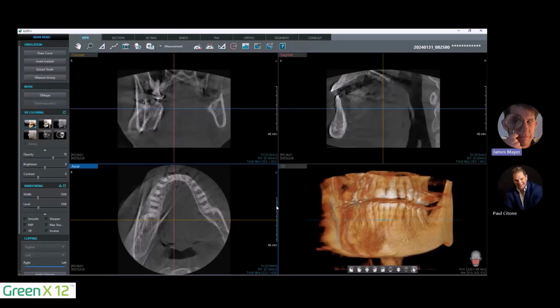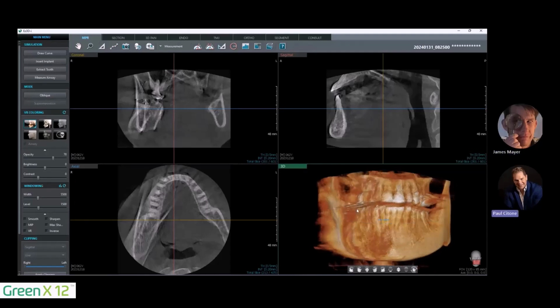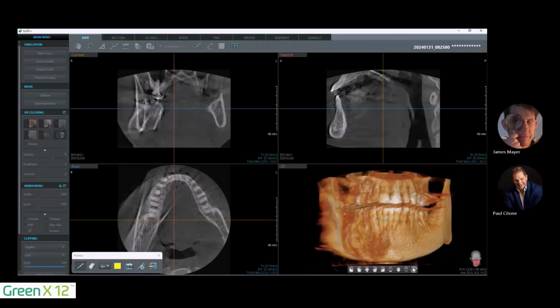And Paul, I'll let you run through, and we can start with the virtual rendering, maybe move the axial and then the coronal, and describe what we're seeing here. In this case, it's a situation where the patient, as the scan was being taken, we can see that one side is fairly clear. They moved during the scan, causing that entire right side there to be completely distorted.